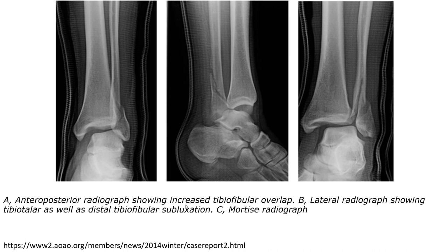The left image is an AP radiograph showing increased tibiofibular overlap. The middle image is the lateral view showing tibiofibular distal subluxation. And the right image is a mortise radiograph.